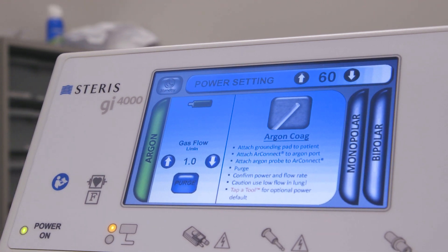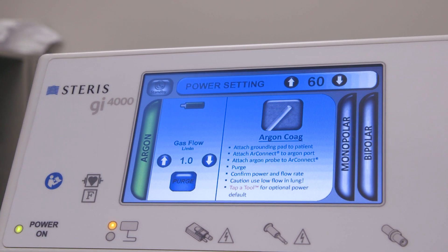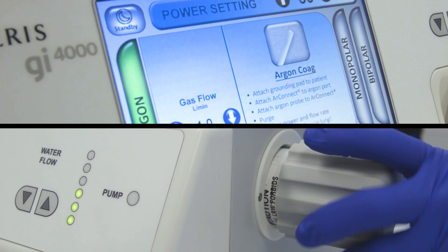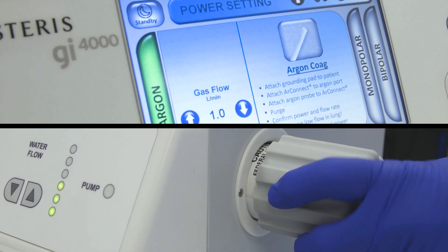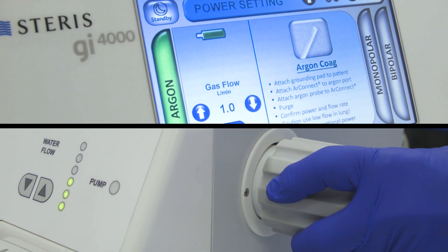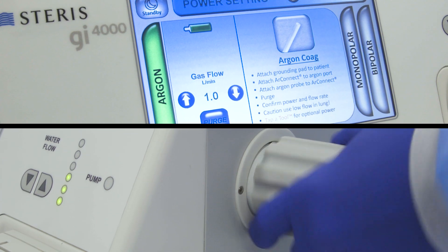Argon bottle is not fully tightened. To resolve this issue, continue turning the bottle clockwise until it is fully engaged. This can be a quarter to two full turns tighter, even after the green gas bottle icon appears on the screen.